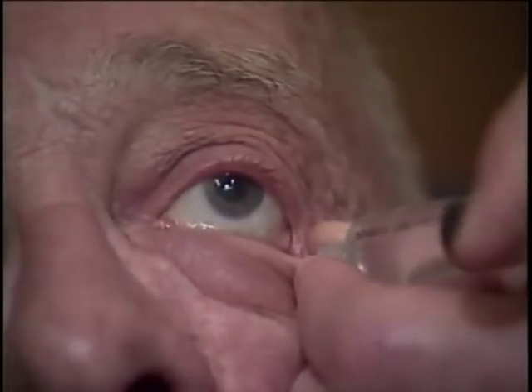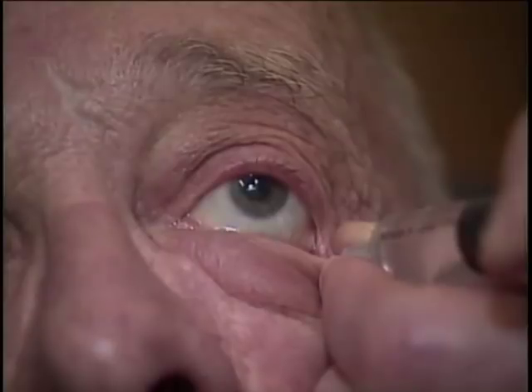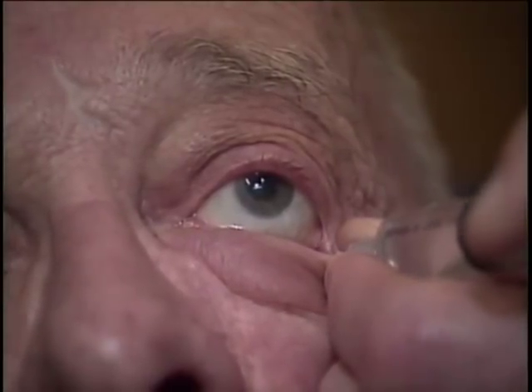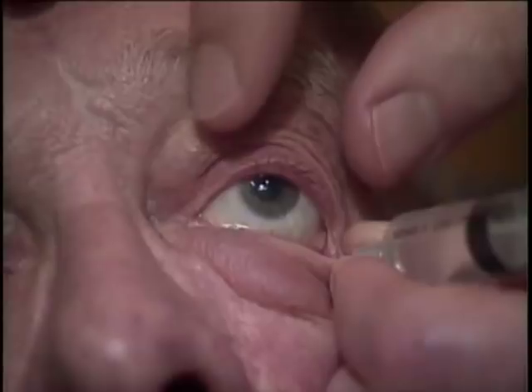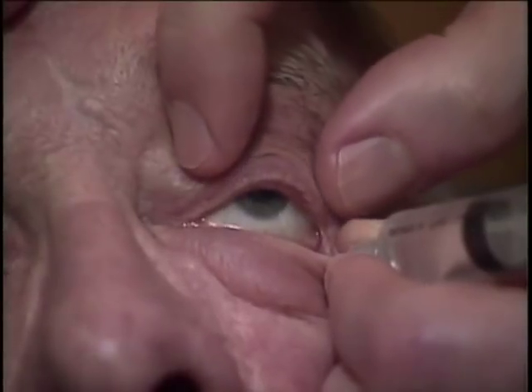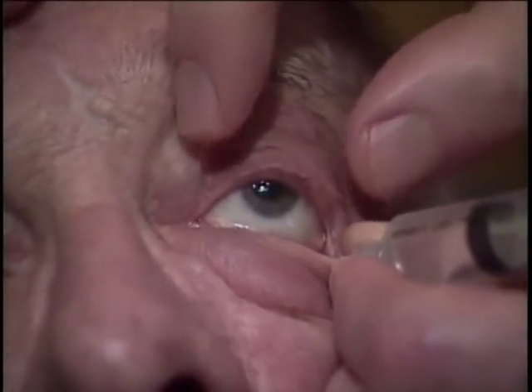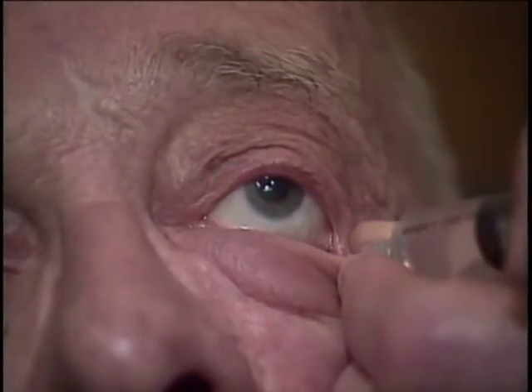The total volume used for this first injection is governed by the increasing orbit pressure, as monitored through the upper lid intermittently with finger and thumb. The secret to patient comfort is the slow injection rate.